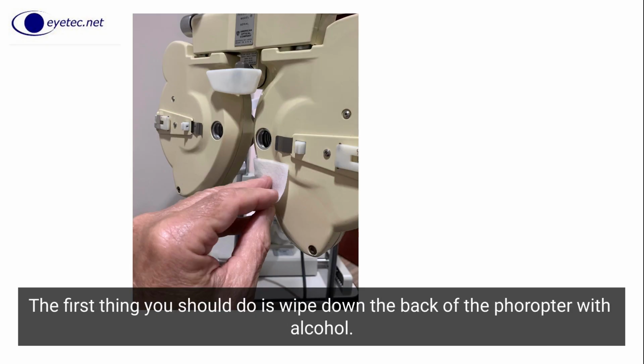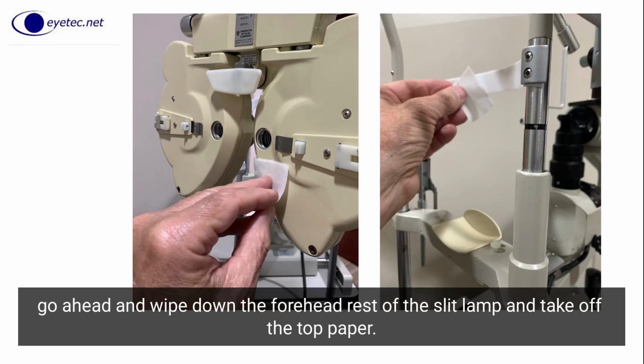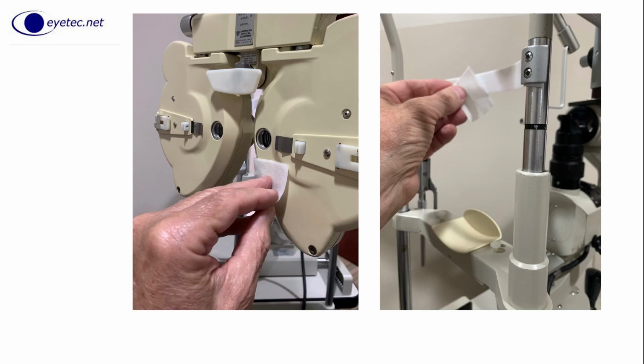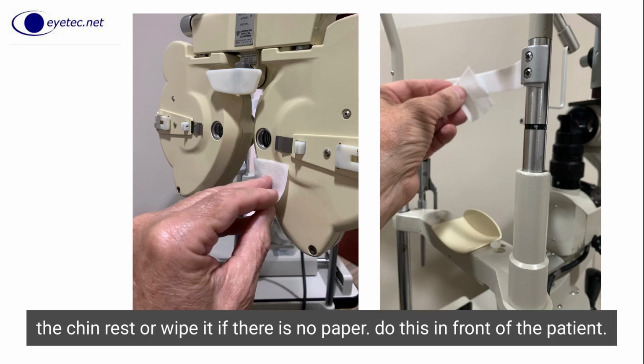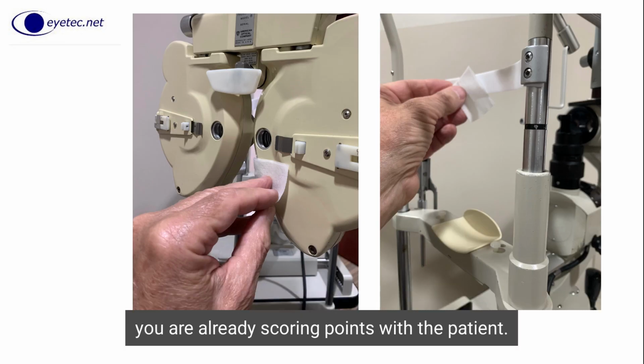The first thing you should do is wipe down the back of the phoropter with alcohol. While you are at it, go ahead and wipe down the forehead rest of the slit lamp and take the top paper off the chin rest, or wipe it if there is no paper. Do this in front of the patient. You will be surprised how many of them appreciate this, and many will thank you for it. You are already scoring points with the patient.